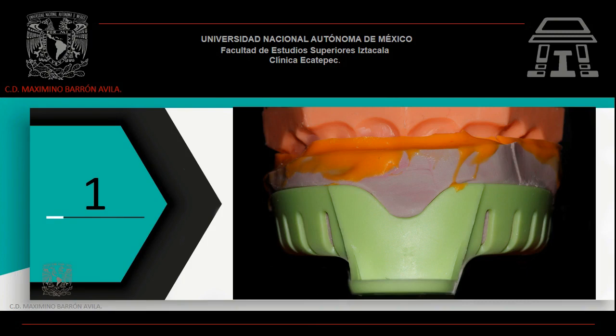Toma una impresión total con silicón pesado y realiza la rectificación correspondiente con silicón ligero. Recuerda: una buena impresión trae como consecuencia un excelente modelo de trabajo.